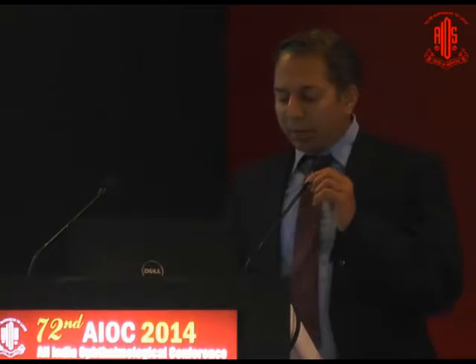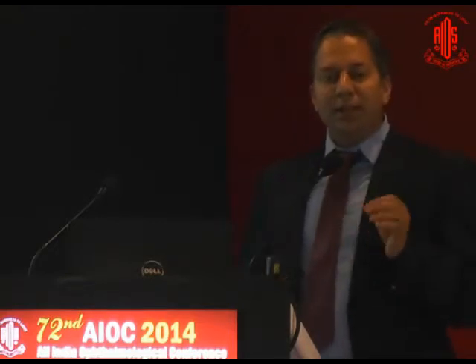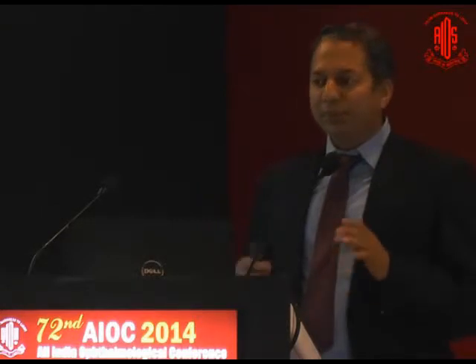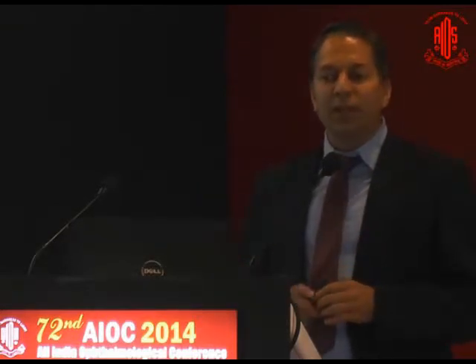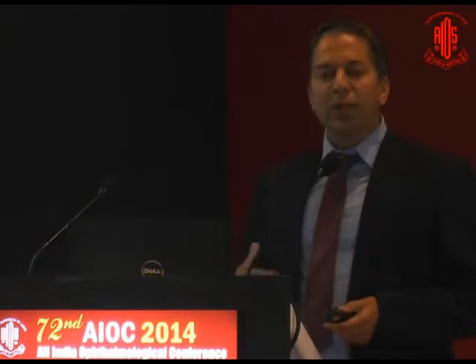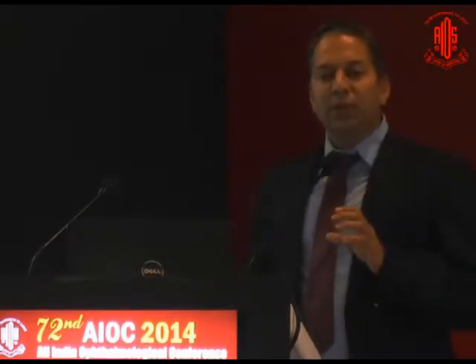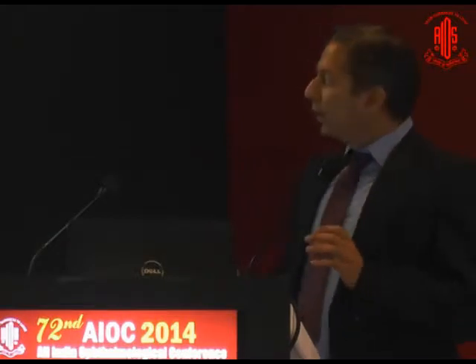In all pediatric cataracts, I'll just give you a few tips. It is imperative to stain these capsules because one can delineate the capsule very nicely, and of course when you're implanting the IOL, things become much easier. In viscoelastics, one has to use cohesive viscoelastics, and 1.4 sodium hyaluronate is one of the best.